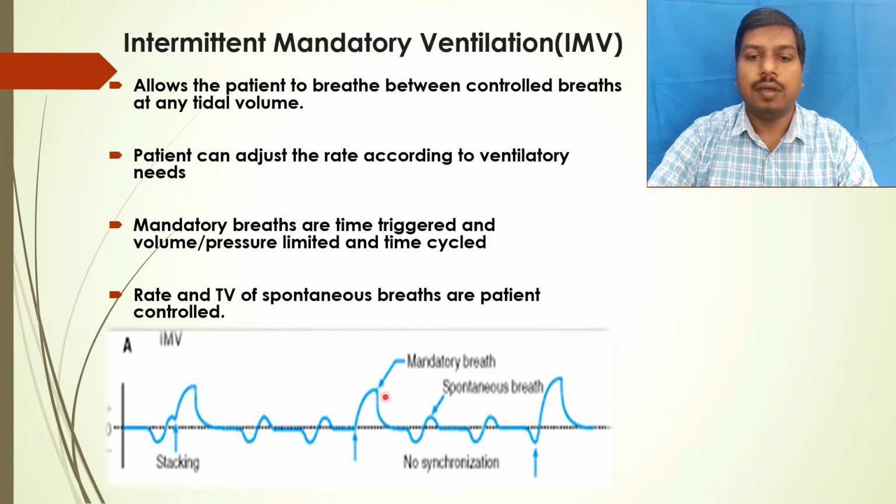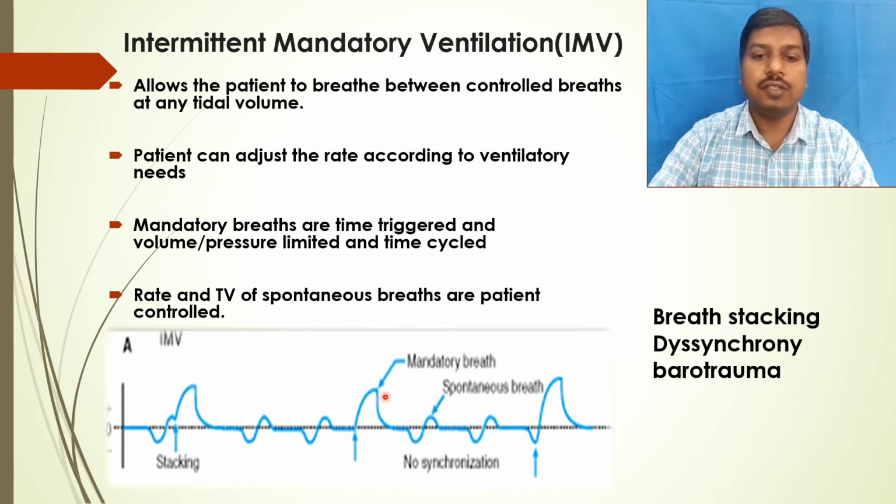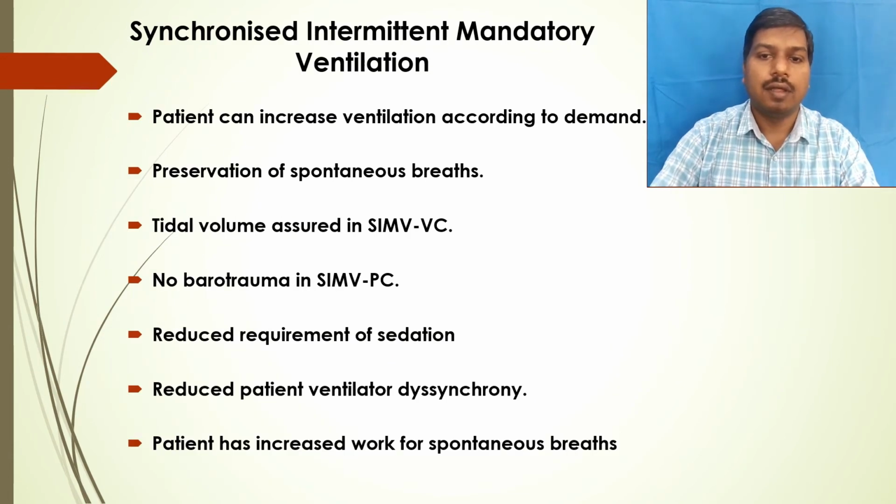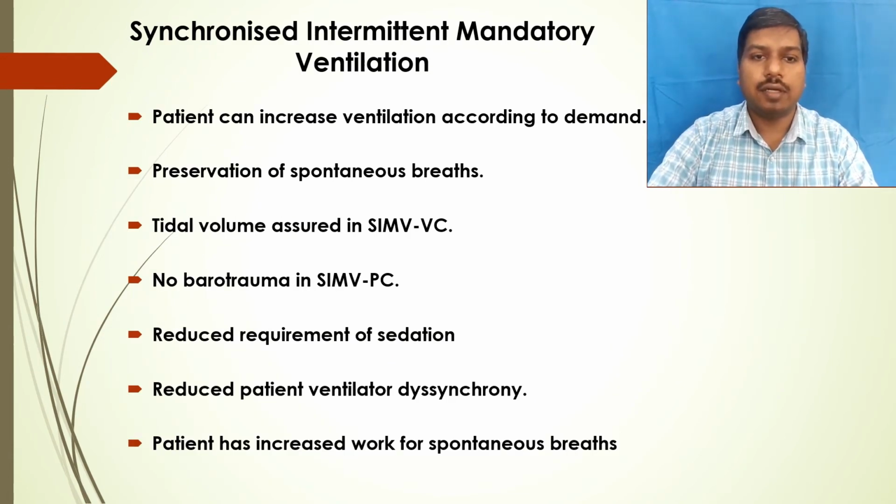So even though the patient breaths are allowed, there are mandatory breaths. So, there is no synchrony between the patient breath and the mandatory breath. So the chance of breath stacking, dyssynchrony, and barotrauma are still there. So in order to rectify that, synchronized intermittent mandatory ventilation came.